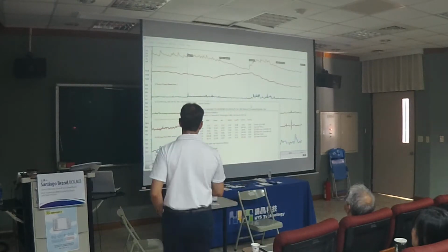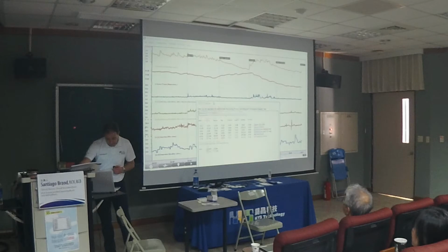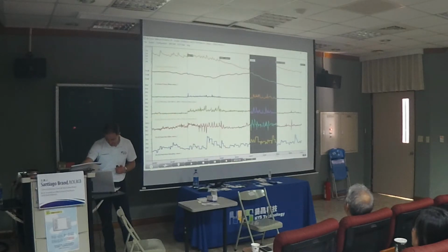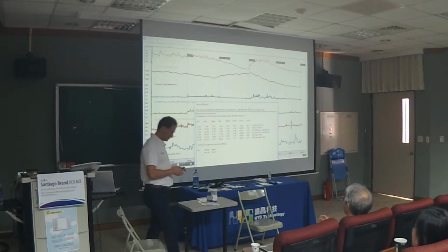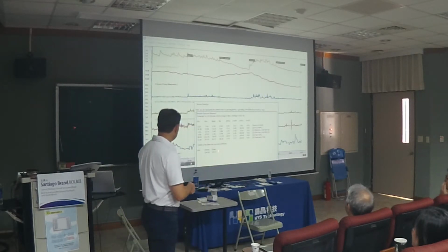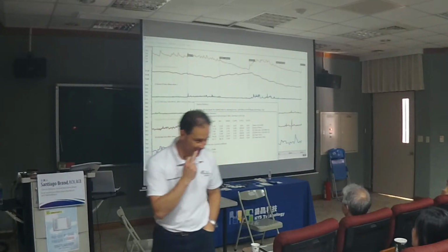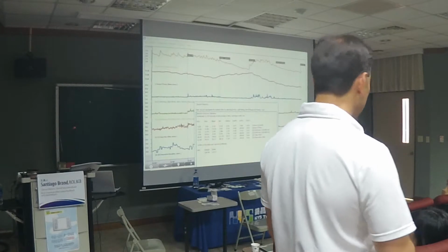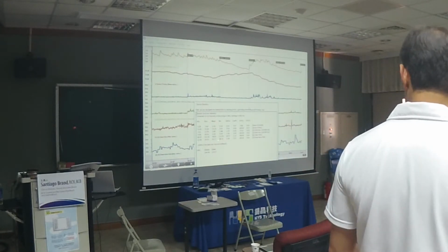So that's good. Now, we're going to stress him again, and this time we're stressing with the client assessments, which is something he clearly hates. So we're going to see how stressed he gets, right? So look at that. The respiration rate went up to 22. So this is something that Willie doesn't really like to do. And we all have, in our jobs, we all have something that we hate. And clearly this is it for him.